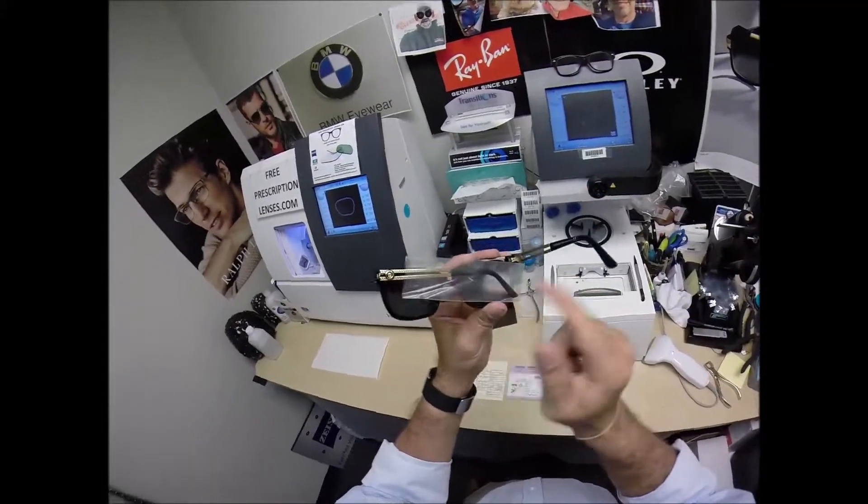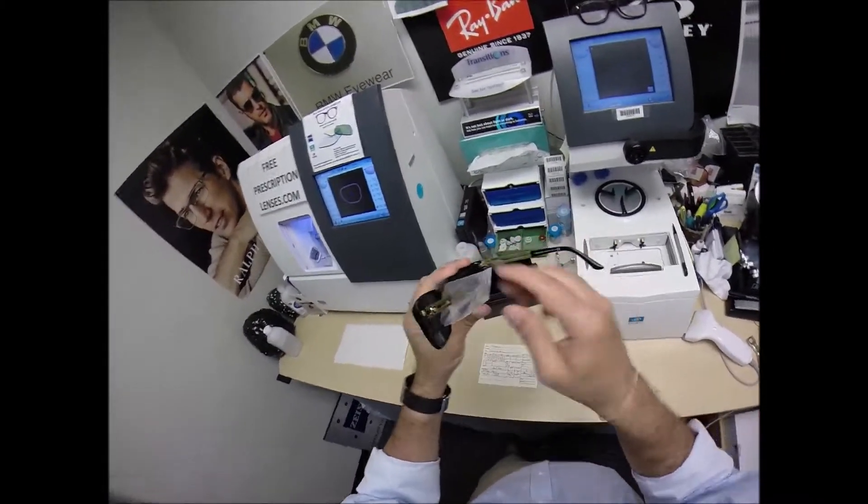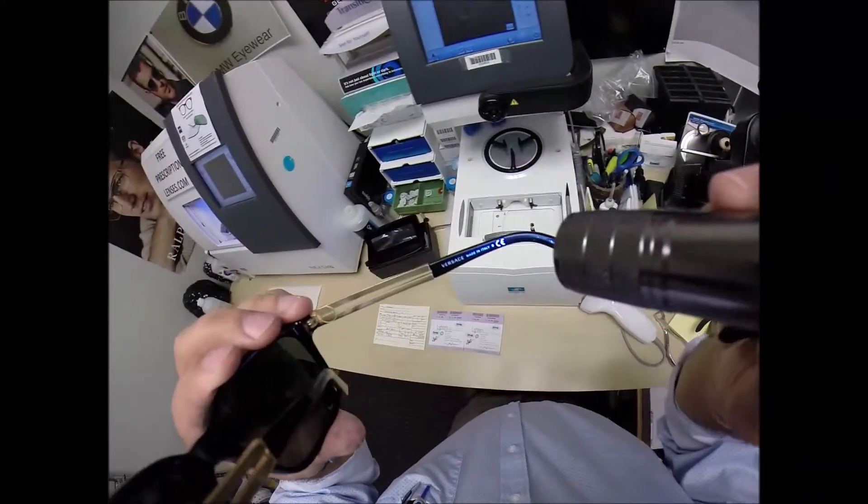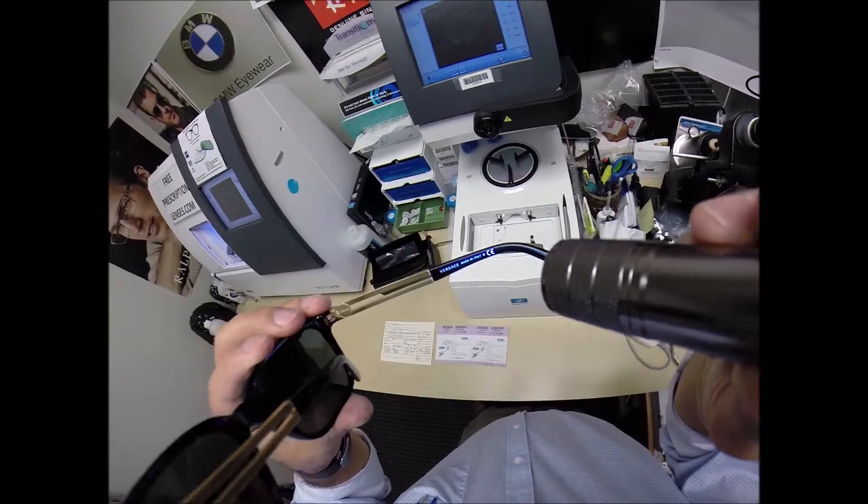It comes with a plastic sleeve on the left temple to protect the temples from rubbing together while it is being shipped from Italy. All Versaces are made in Italy.